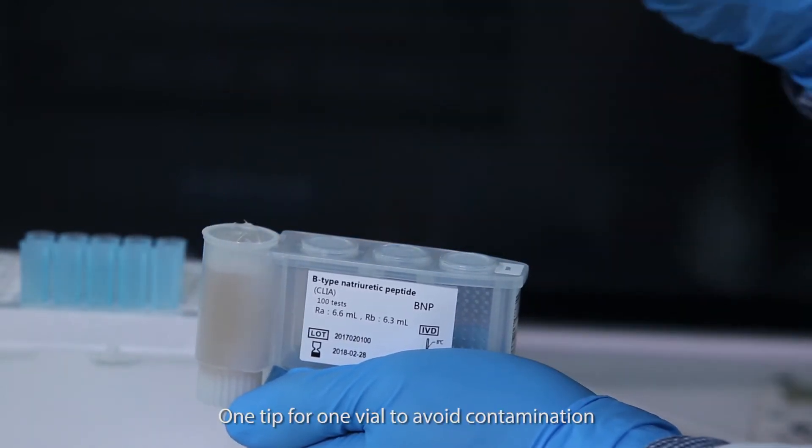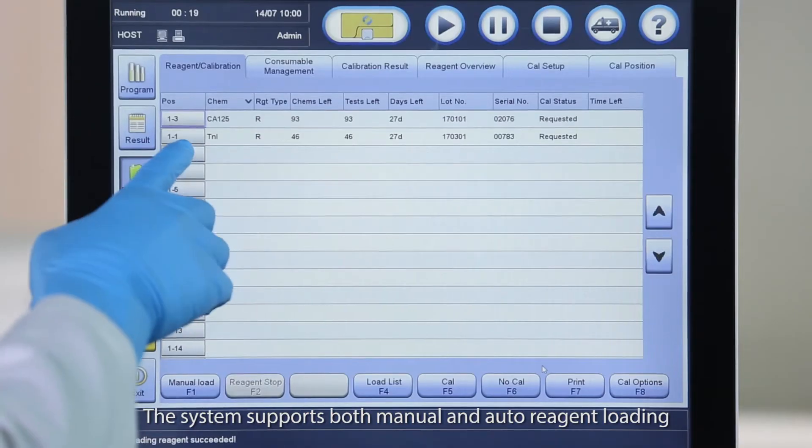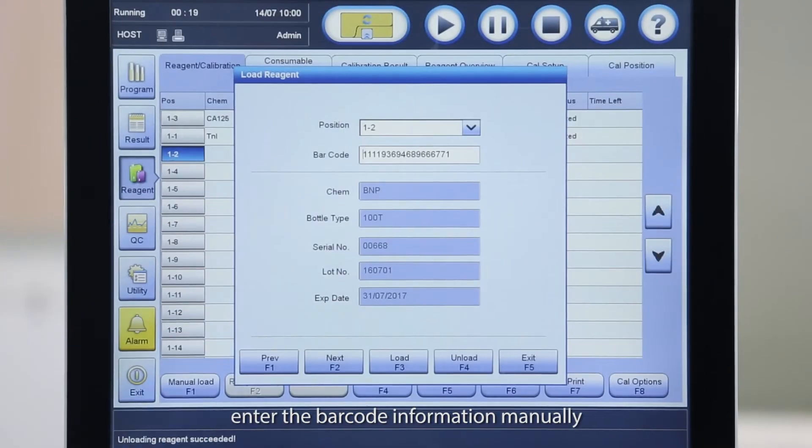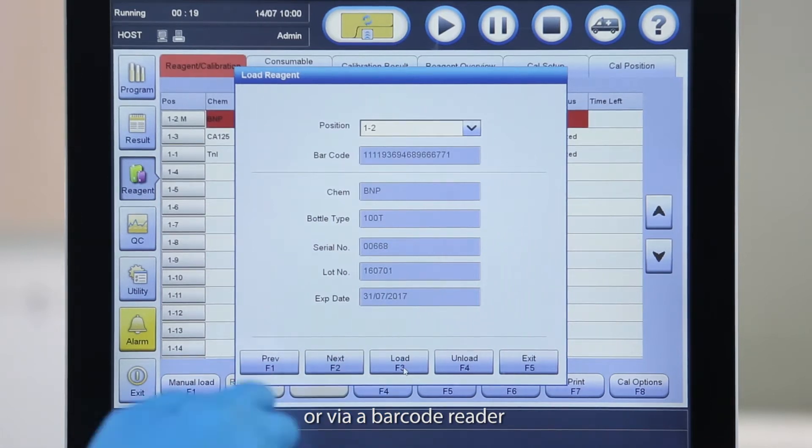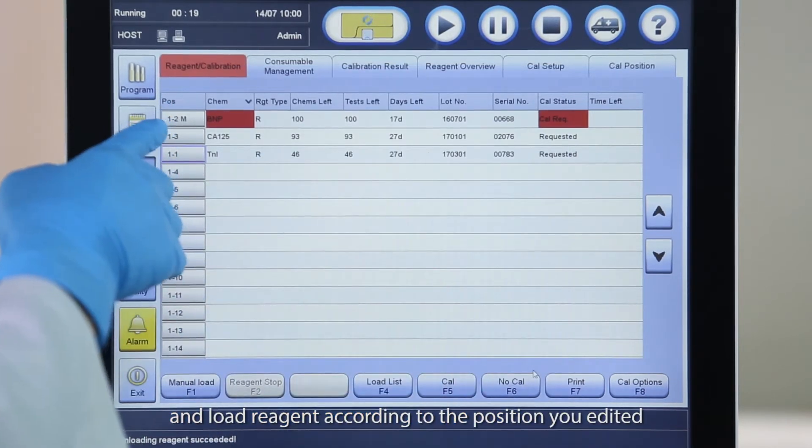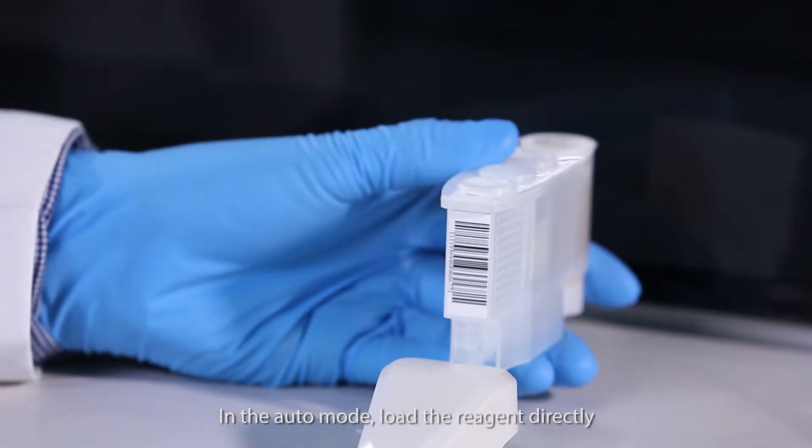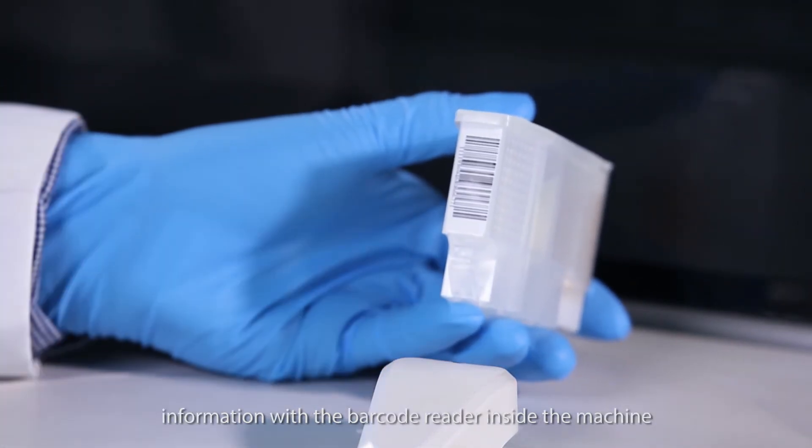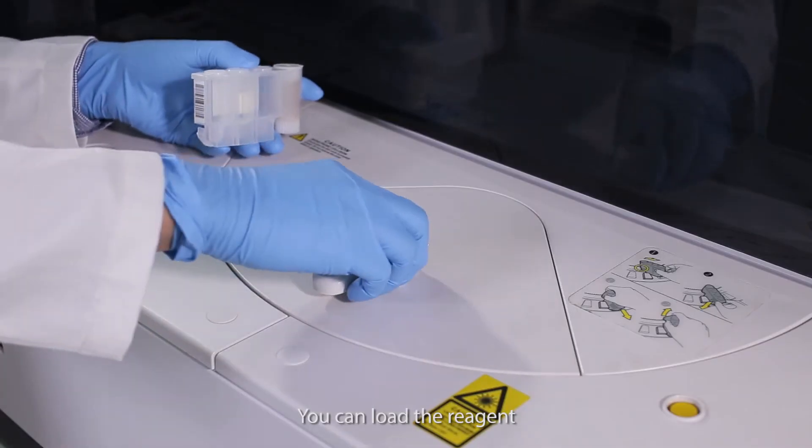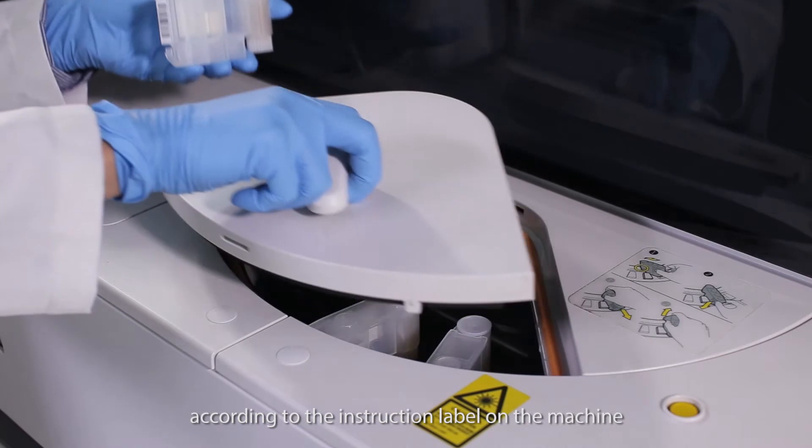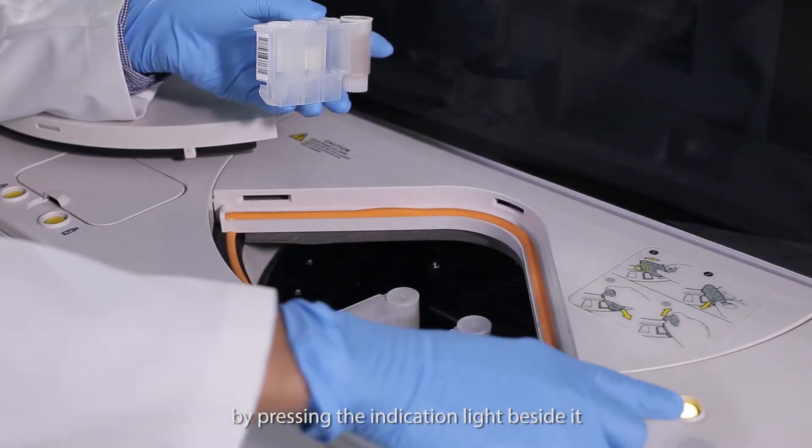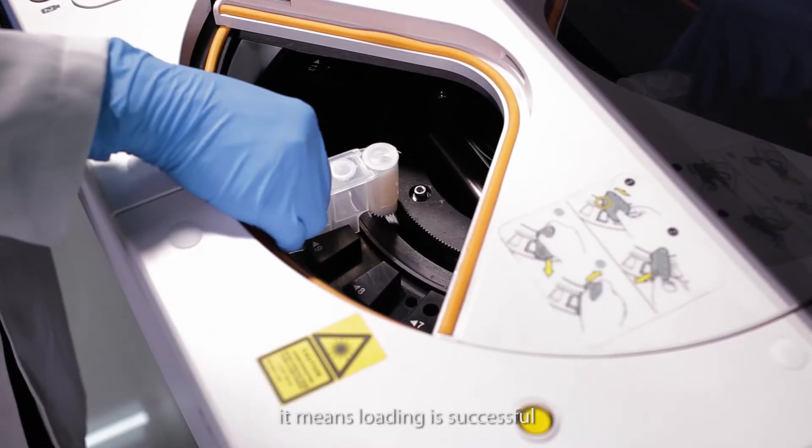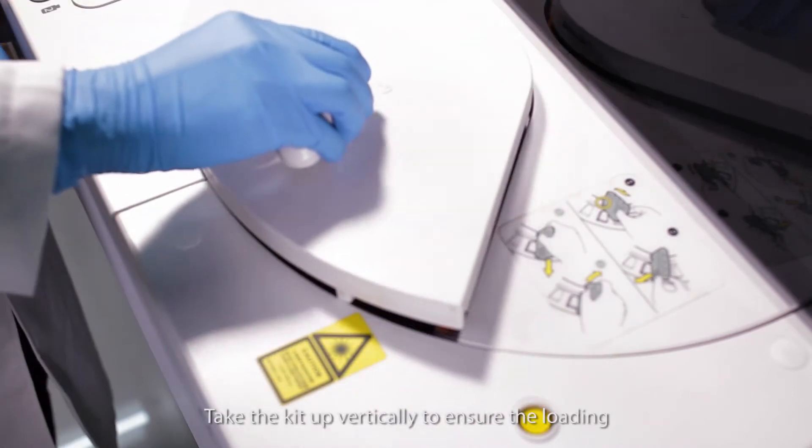One tip for one vial to avoid contamination. The system supports both manual and auto reagent loading. In the manual mode, enter the barcode information manually or via barcode reader and load reagent according to the position you edited. In the auto mode, load the reagent directly and the system will scan the reagent information with the barcode reader inside the machine. You can load the reagent according to the instruction label on the machine. Move the reagent carousel by pressing the indication light beside it. Hearing a click, it means loading is successful. Take the kit up vertically to ensure the loading.